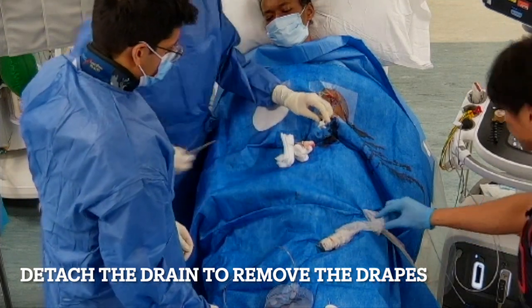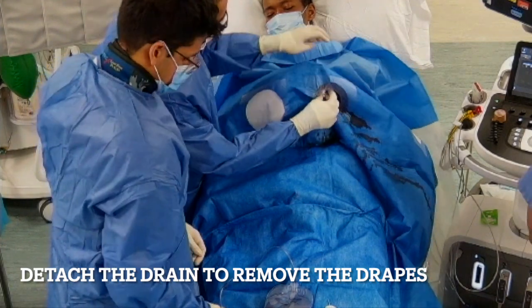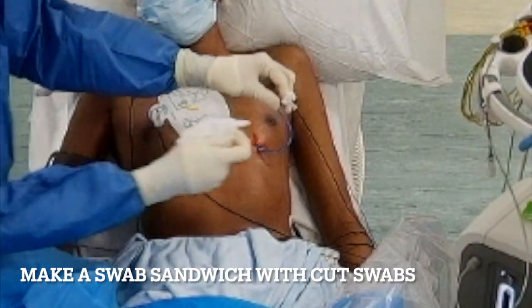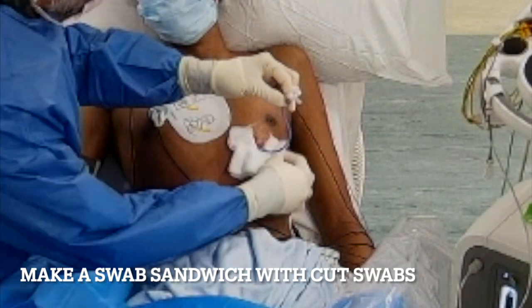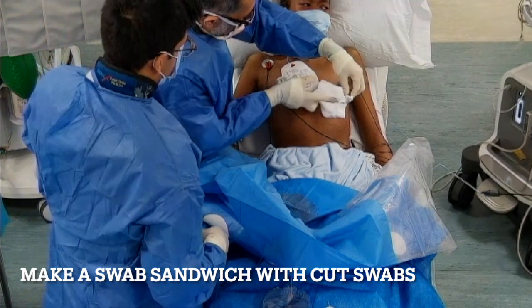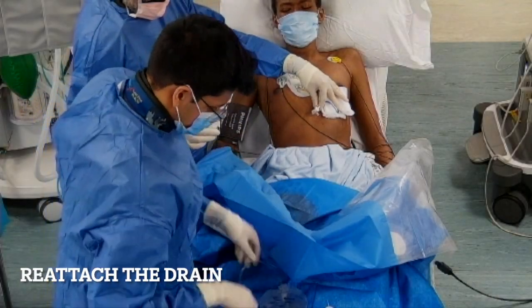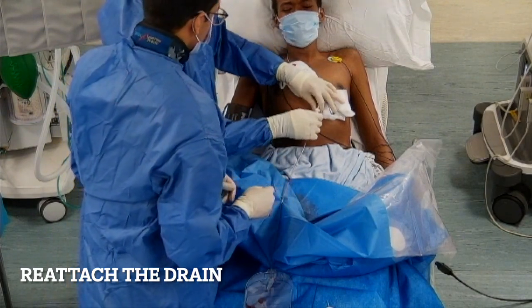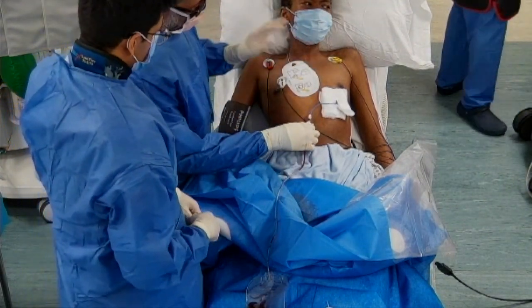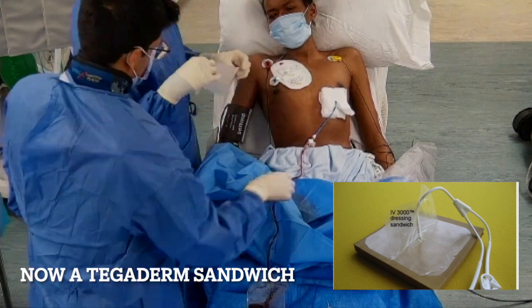We detach and remove all the drapes, being careful the ultrasound probe doesn't fall on the floor — an expensive mistake. We cut swabs to the middle so one goes underneath and one goes over the entry point, creating a cushion. This keeps the site sterile and prevents a sharp right-angle bend in the drain. We reattach the drain and apply a sandwich of Tegaderm to maintain sterility.